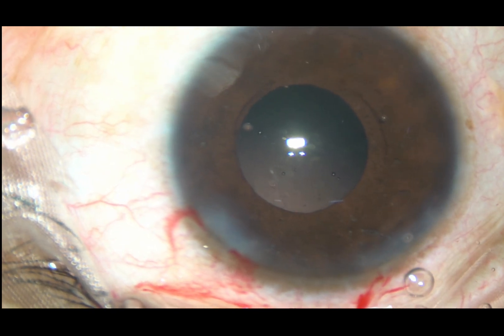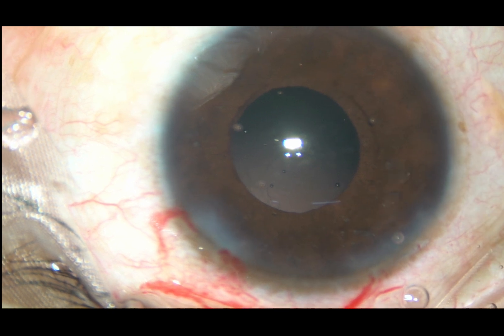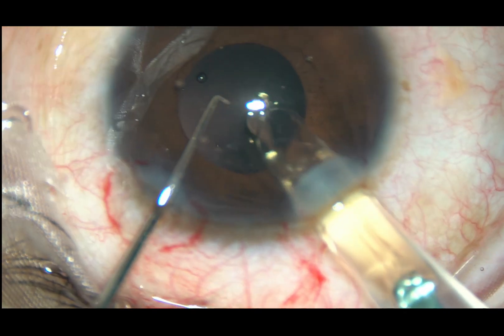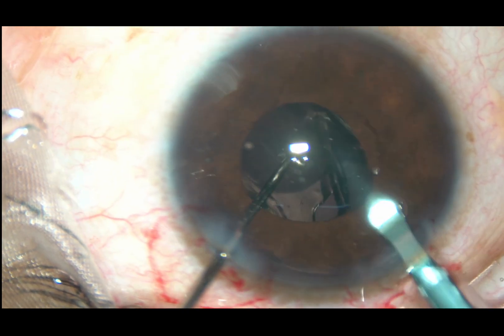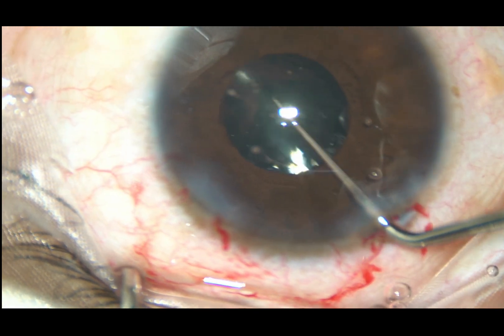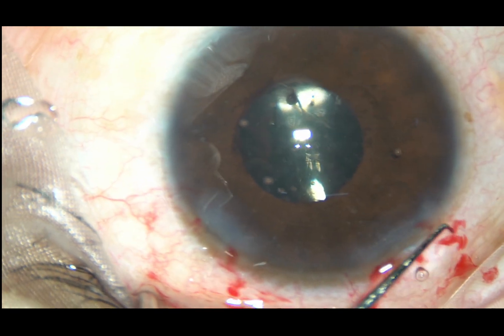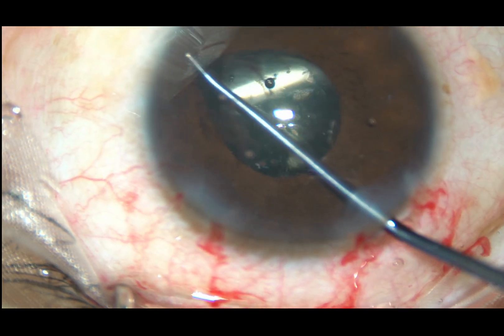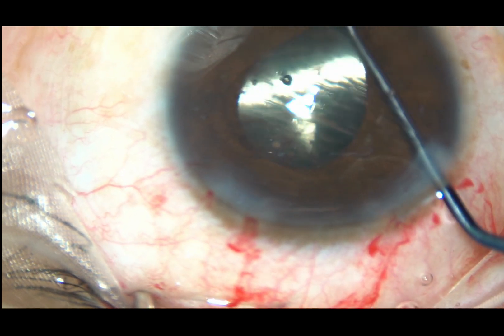And now some more viscoelastic is injected. A hydrophobic acrylic single-piece yellow intraocular lens is being implanted — here goes the lens. The leading haptic goes into the capsular bag and the trailing haptic is also placed in the bag. To confirm whether it is in the bag or not, we inject some more viscoelastic substance and use the same Y-shaped instrument to retract the iris and check. Yes — the lens is in the capsular bag.